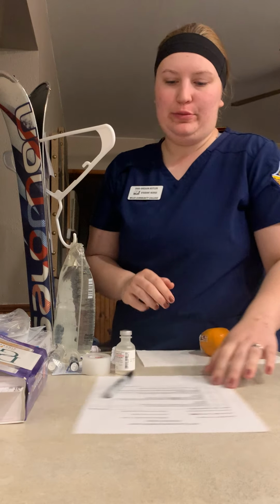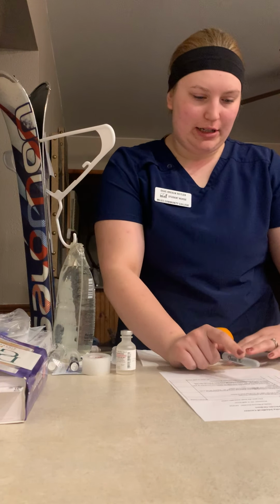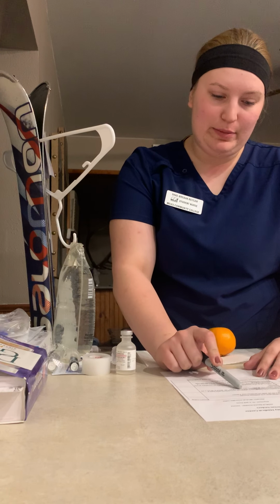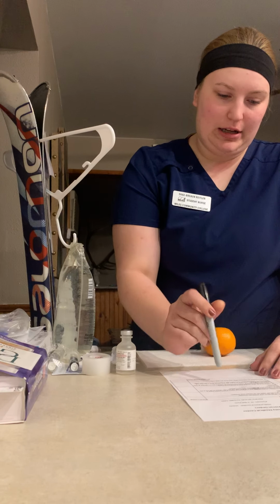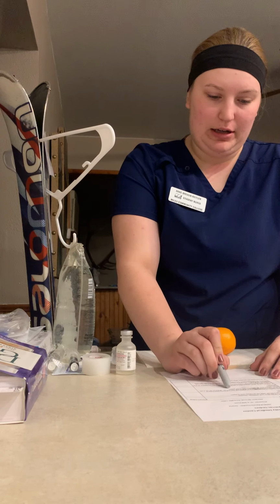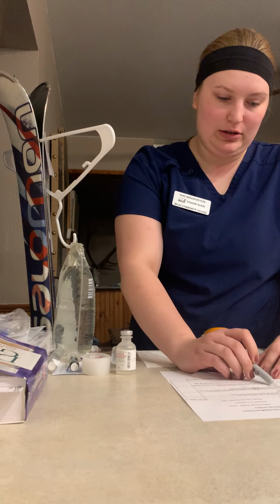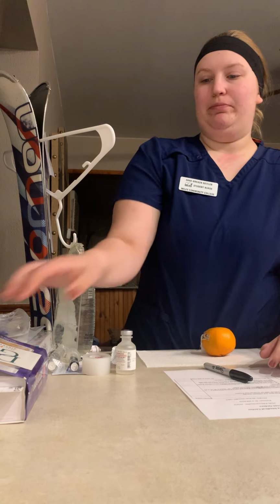I'm going to go to the med room, and I'm going to check my MAR. So my order is to administer claforin 560 milligrams IV piggyback every 8 hours. My reconstituted bottle of claforin is 500 milligrams per milliliter. Place in 50 milliliters, 0.9 normal saline. Infuse over 45 minutes. Give 4 doses.